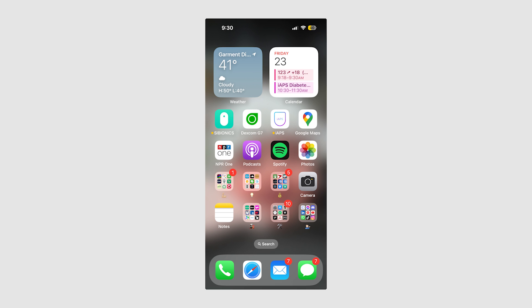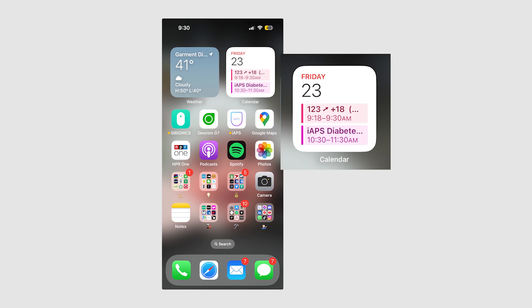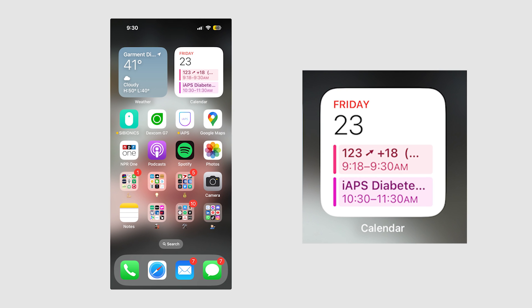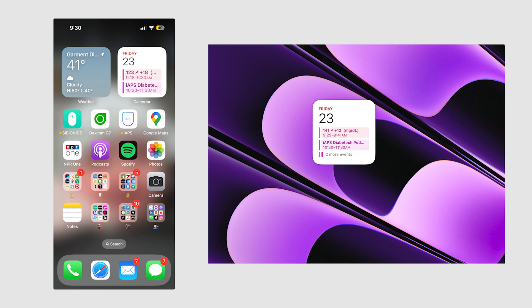Now that that's all set up, you will have events sent to your Apple Calendar from Sugarmate every five minutes with a new reading. These readings will have a number, an arrow showing you the direction the glucose reading is going, and the delta — the change in glucose reading from the last one five minutes ago. You're going to get an event every five minutes, and it will even show the time period that that sugar reading came from.